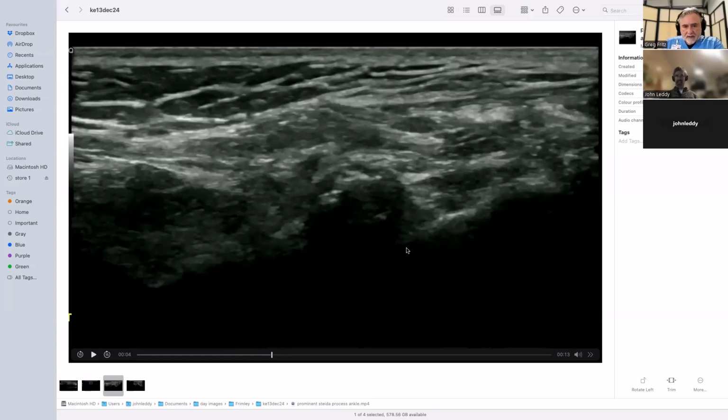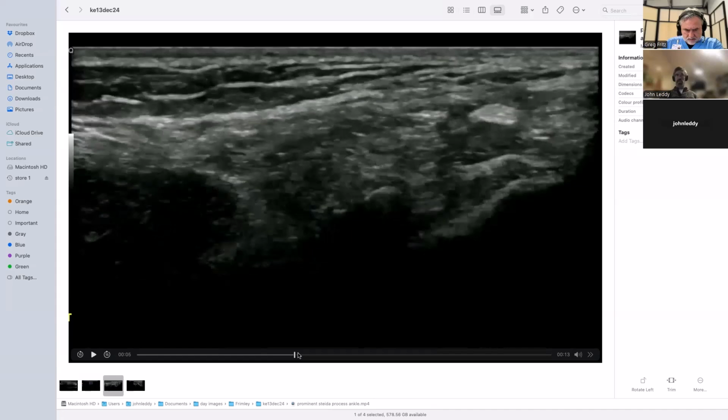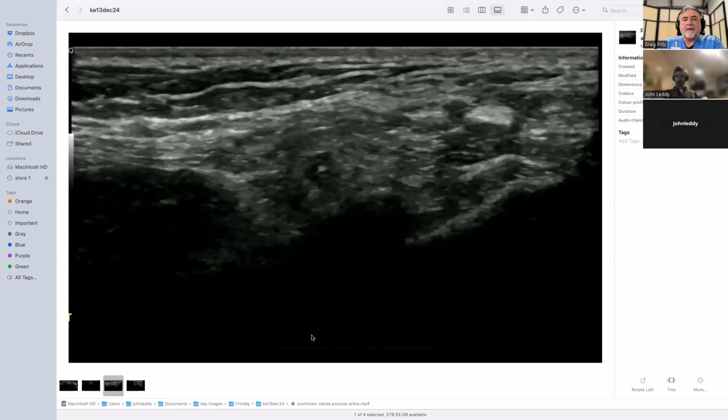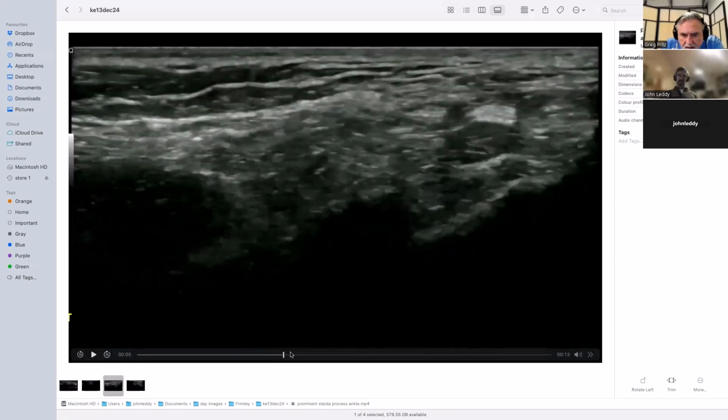Oh, okay. And it can lead to posterior impingement, where it gives a similar sort of presentation to an os trigonum. So where you have something in the back behind the talus that impinges, in patients who plantar flex, they get pain on plantar flexion, sometimes ballerina type. And this Steida process just looks a little bit untidy.